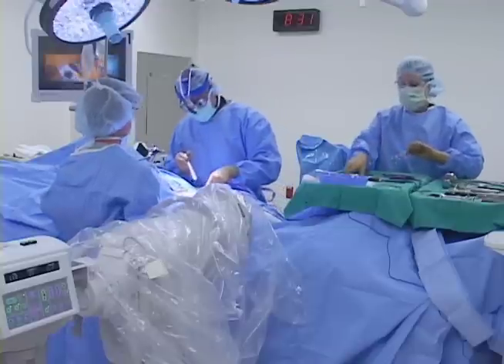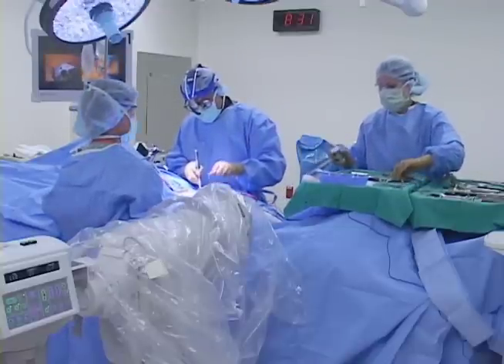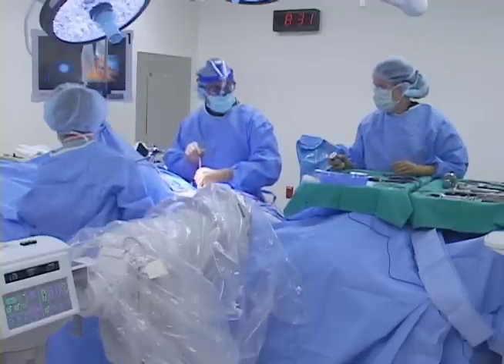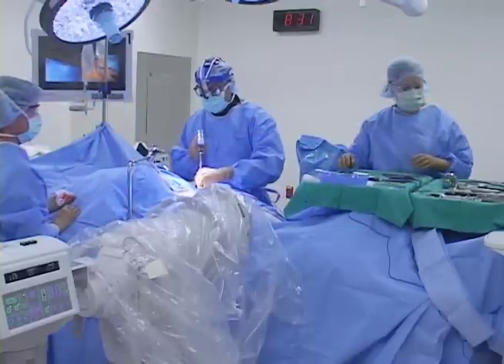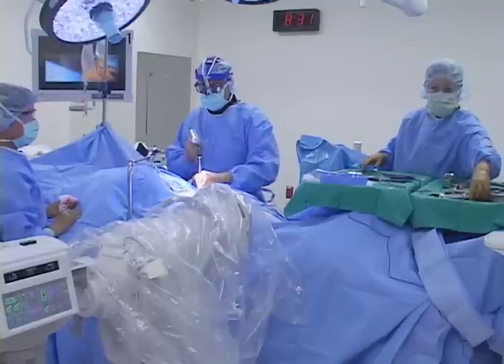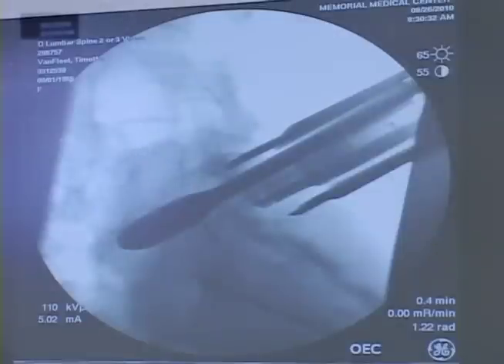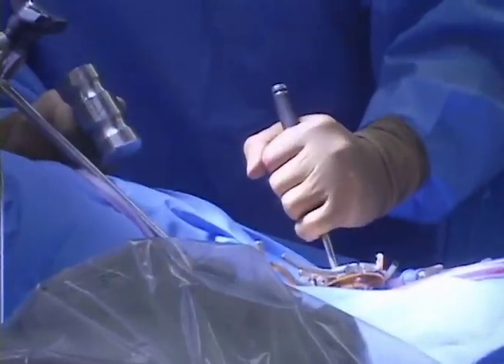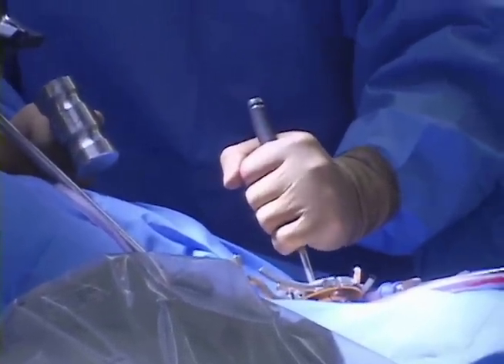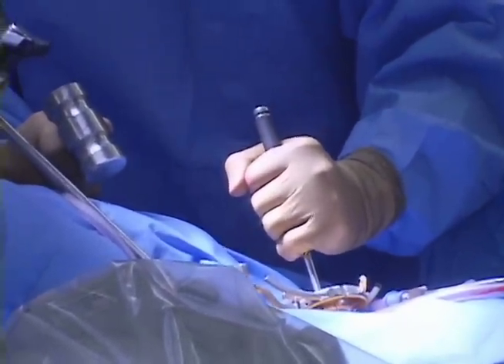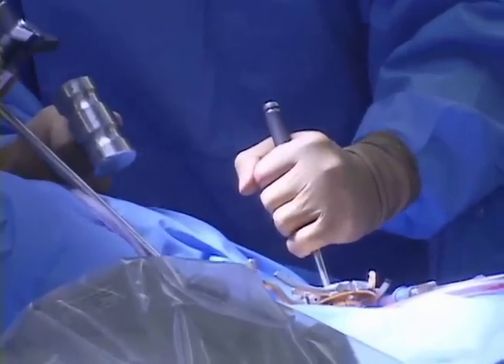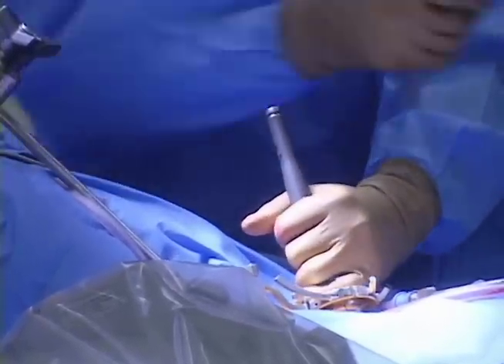We're going to begin trialing with a spacer and check this out with x-ray to see how it feels going in. She's going to be a 27 — she's not very long as far as the cage is concerned. Sometimes we use longer cages. What I go by when I put this in is the tension of the spacer; I can feel how tight it is. I can actually lift the patient up with the spacer in place, and that tells me I'm starting to get a good interference fit.